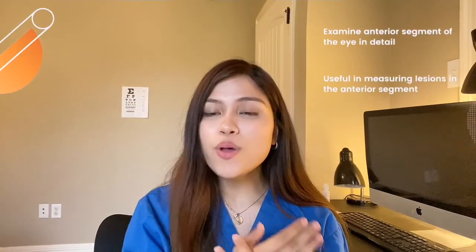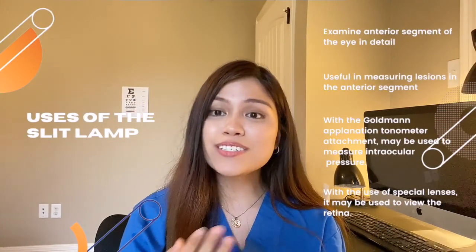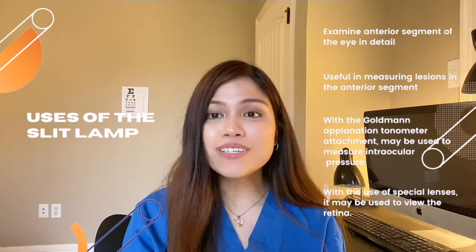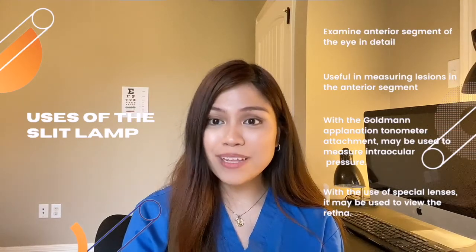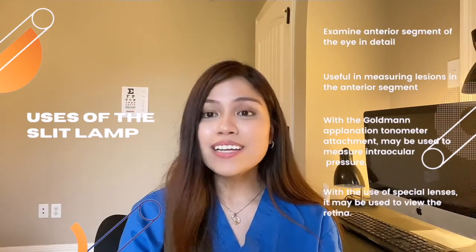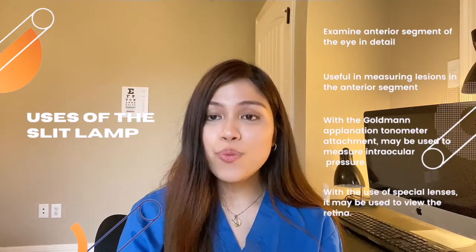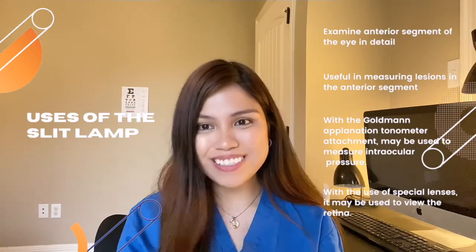The slit lamp has also various uses. It can be used to examine the anterior segment of the eye in detail. It is also useful in measuring lesions in the anterior segment of the eye. With the Goldmann applanation tonometer attachment, it is also used to measure intraocular pressure. Lastly, with the use of a special lens, it can also be used to view the retina. And that is all for the 8-part eye exam.